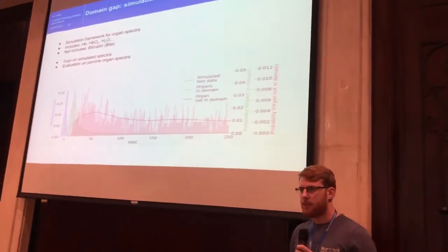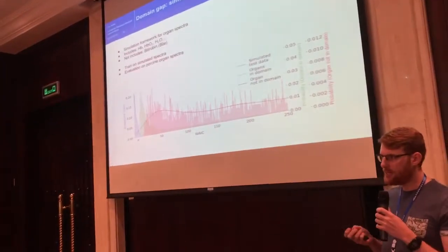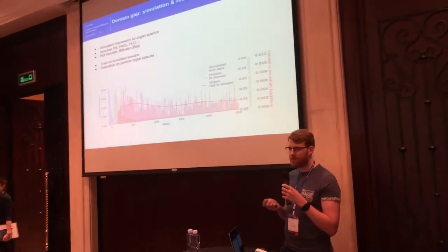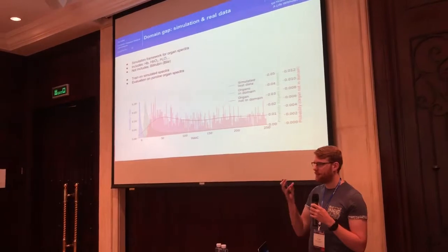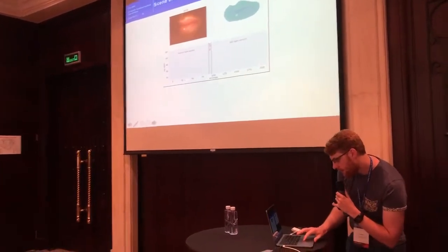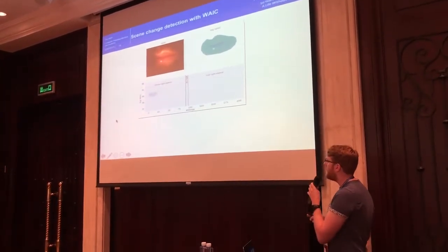Yeah. And then we also did one last experiment as a sanity check, because also for our framework, of course, the lighting conditions are important, because the light source influences how the spectrum looks like, and sometimes it happens during surgery that the lighting will change, and we were looking at can we pick up on that. And for that, we took a healthy human volunteer, namely me, and took a laparoscope and took laparoscopic images of my lip and changed the lighting at some point. And just had a look whether we were able to pick that up.